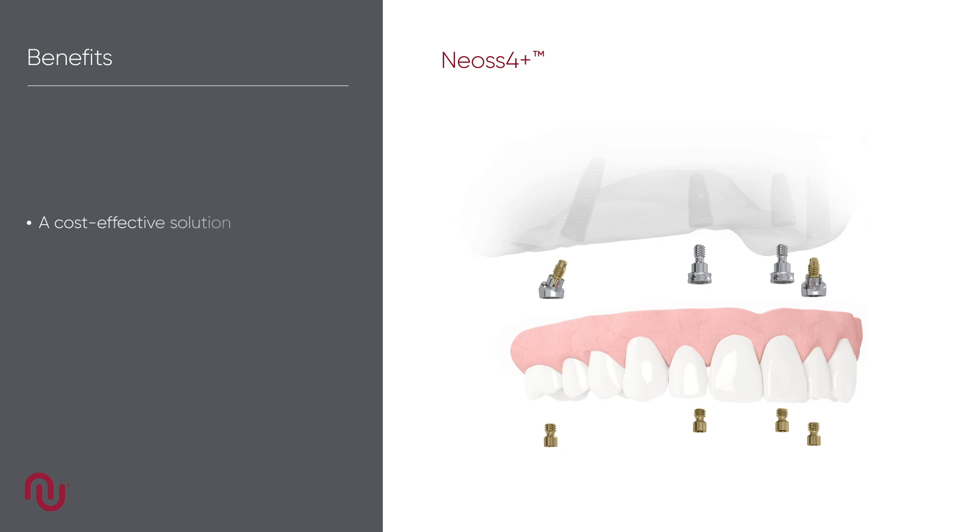The Neos 4 concept is a cost-effective solution offering the advantages of screw-retained prosthetics. In many cases it minimizes the need for grafting and is compatible with flapless surgery. Immediate provisionalization and function with Neos 4 Plus is easily achieved.